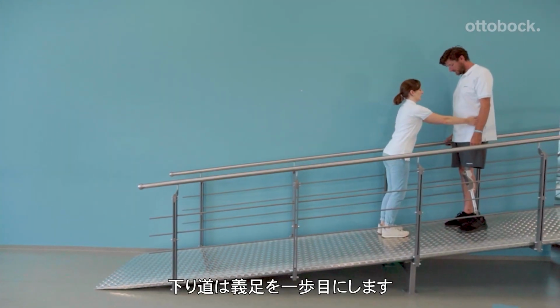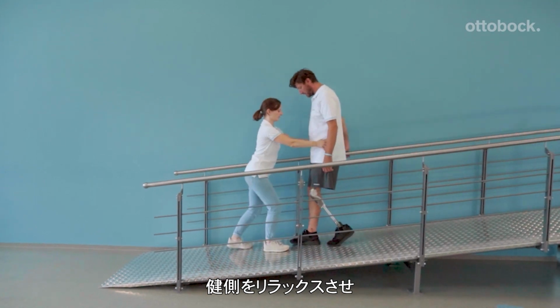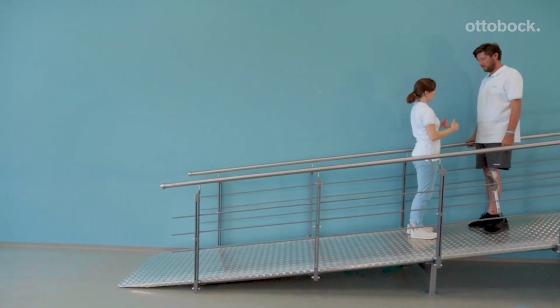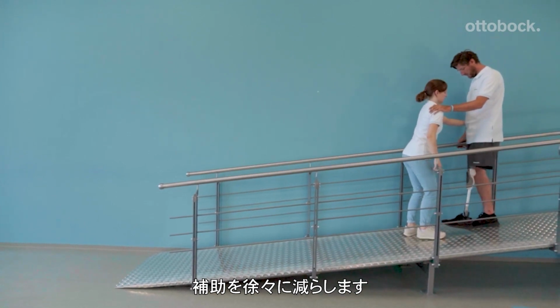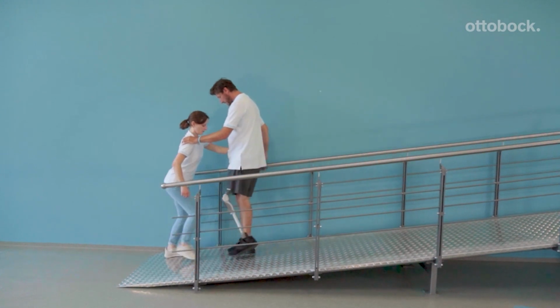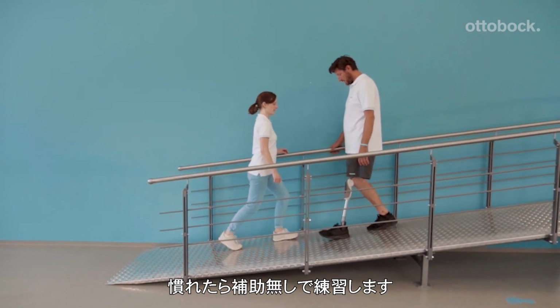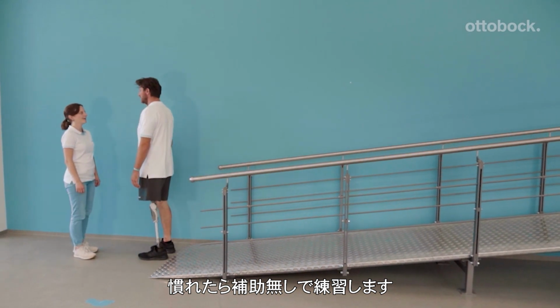When walking down a slope, he starts with the prosthetic side first, keeps the residual limb relaxed, allows knee flexion, and rolls over the entire foot. With progress, the therapist reduces support, but can still provide correction as necessary. When our model is confident enough, he should practice going down the ramp without assist, and the therapist can correct as necessary.